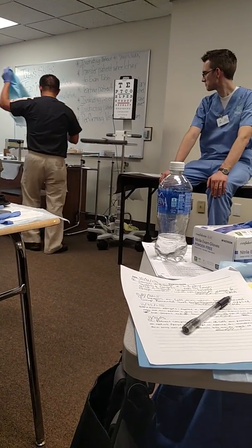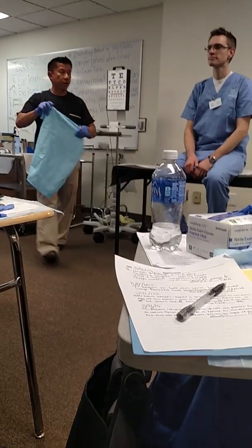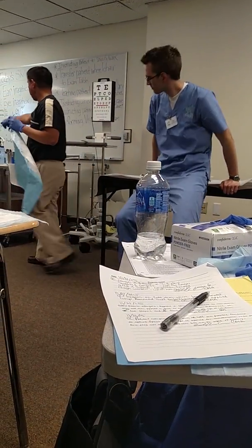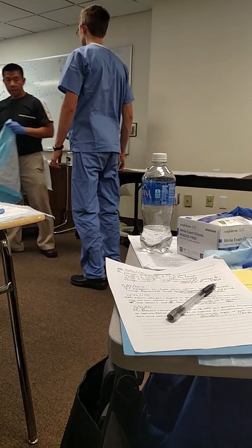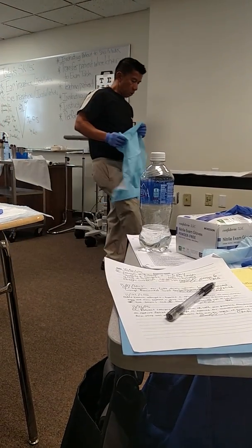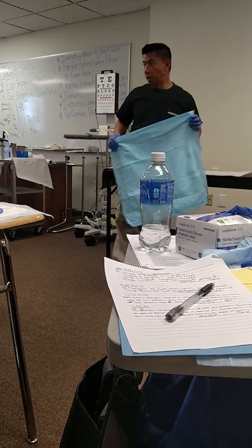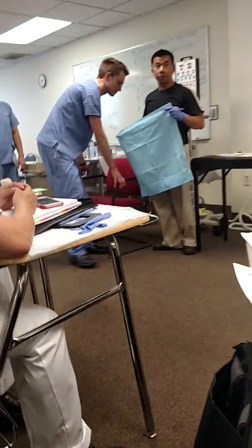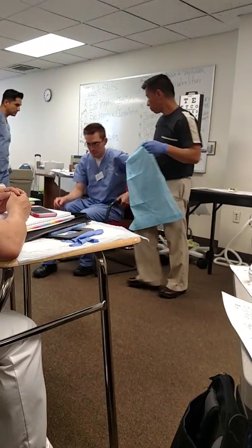Here are your supplies to perform the ear irrigation. That's too high for me, and I'm having a hard time. If you're the MA, I'm going to have him sit on the chair, please. Want to make sure that the patient is comfortable, and you are comfortable as well, because if you are not comfortable, you could possibly injure the patient. Are you guys with me?